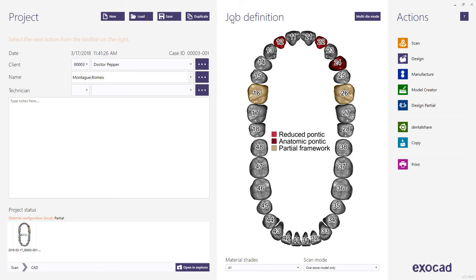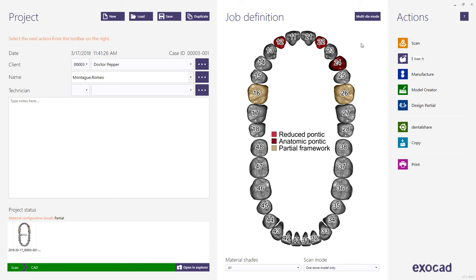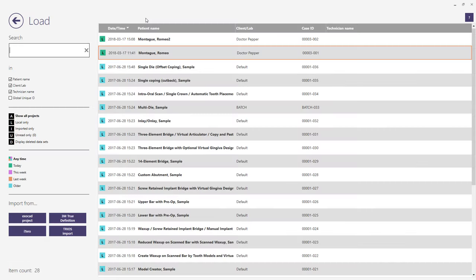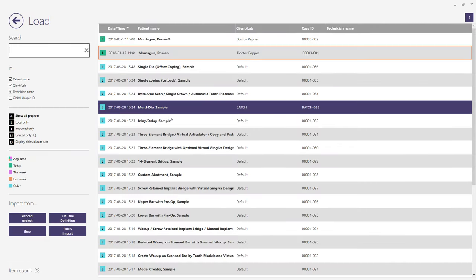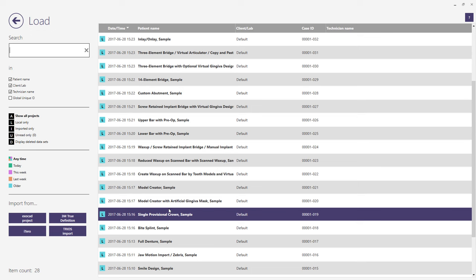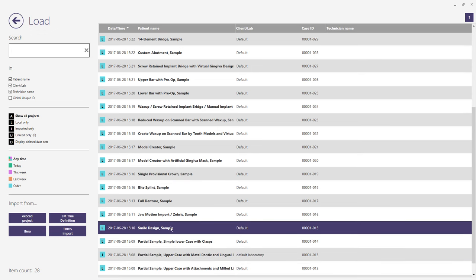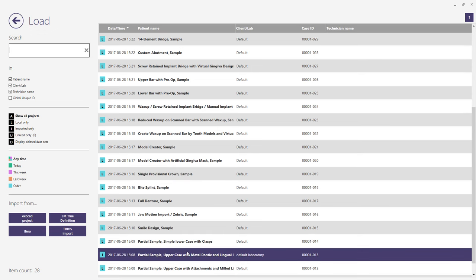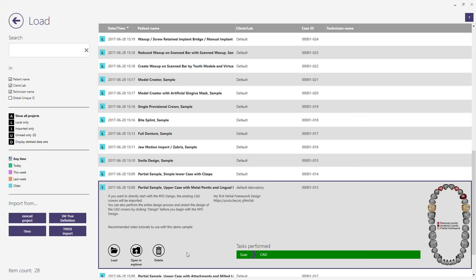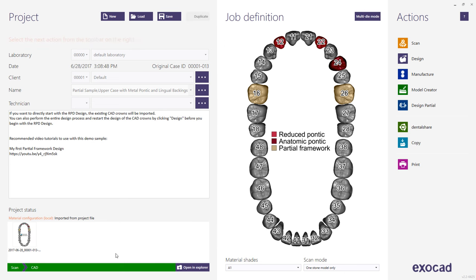If you will be scanning a model, choose Scan in the Actions menu. For this example, we will load the sample case provided in the ExoCAD software. Choose Partial sample, upper case with metal pontic and lingual backings. Next, choose Design from the Actions menu.